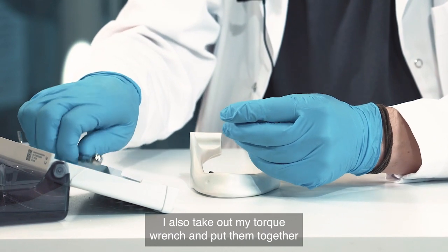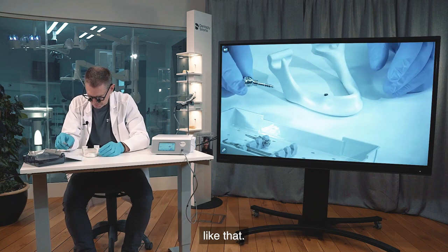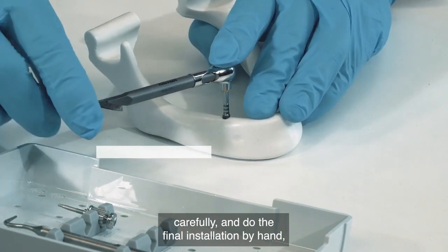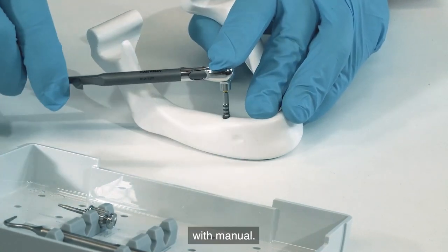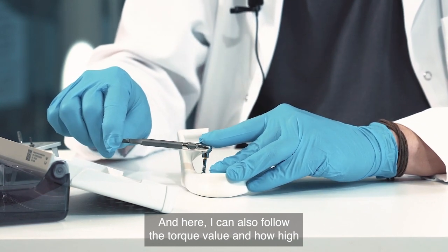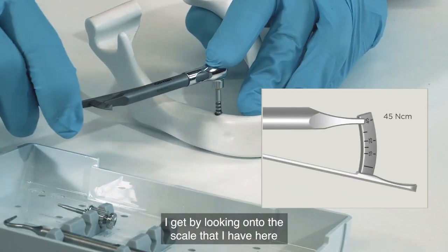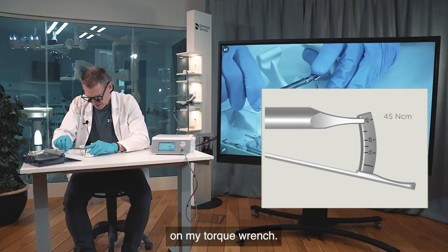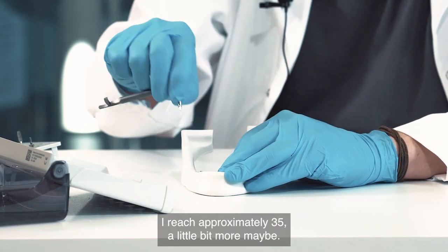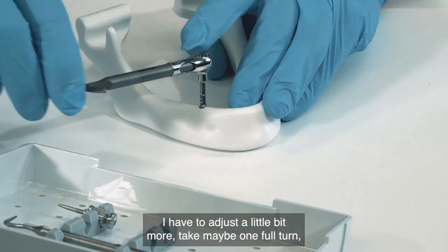I take out the torque wrench and connect them together, then place it back into the implant perpendicular and carefully do the final installation by hand manually. I can follow the torque value by looking at the scale on the torque wrench — I reach approximately 35 Newton centimeters, maybe a little more. I check that I am at bone level, flush with the bone. I need to adjust slightly, perhaps one full turn more.